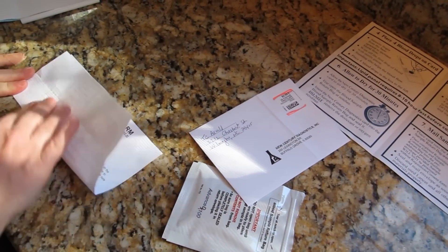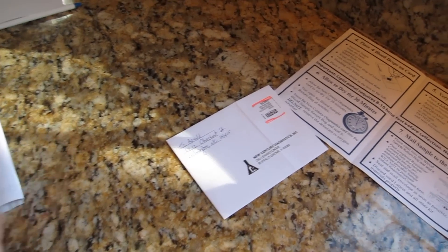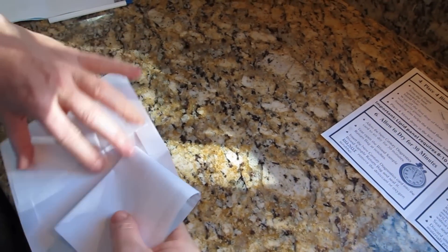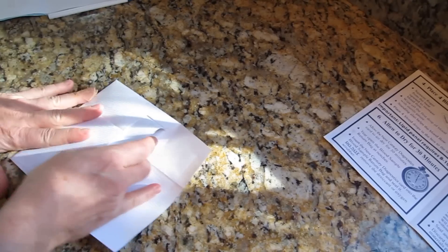Your sample cannot be processed without your requisition consent form enclosed in the envelope. Seal and mail the envelope as soon as possible. You can now discard the other items that were in your kit, including the lancet and other items.